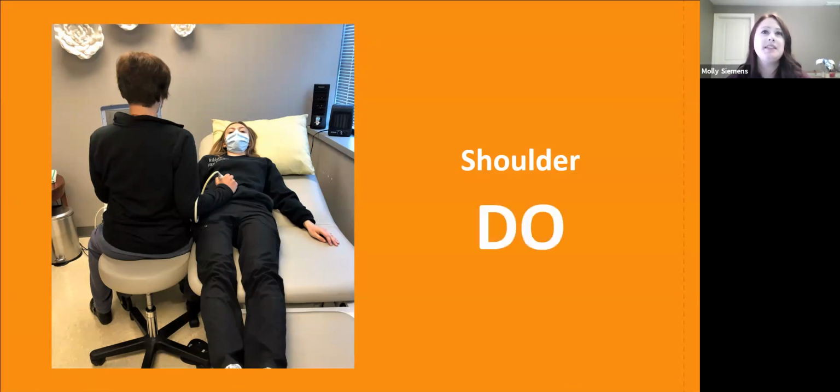As you can see in this demonstration, our patient is to the right of the center of the bed, but still adequately supported. Our sonographer's arm is also in a neutral position, definitely less than 45 degrees. Of course, this is something that is much easier to undertake in outpatient settings when our patient is quite mobile. For inpatient settings, especially those in which our patient is completely immobile, adjusting position is difficult, if not impossible.